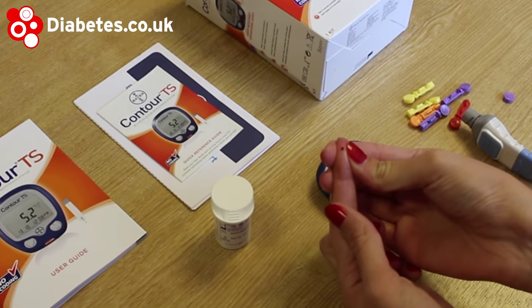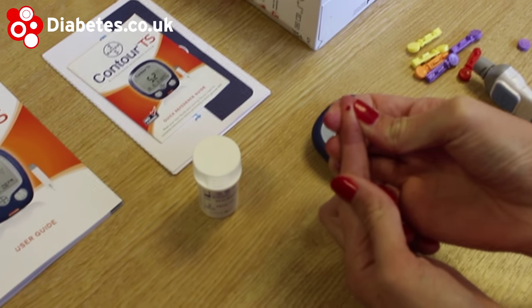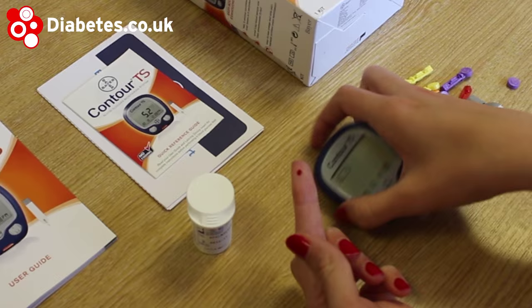A drawback to the Contour TS, however, is that it is not as accurate as some of the other Bayer meters.